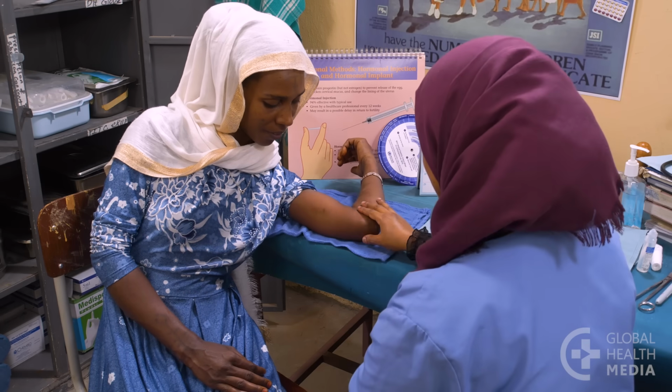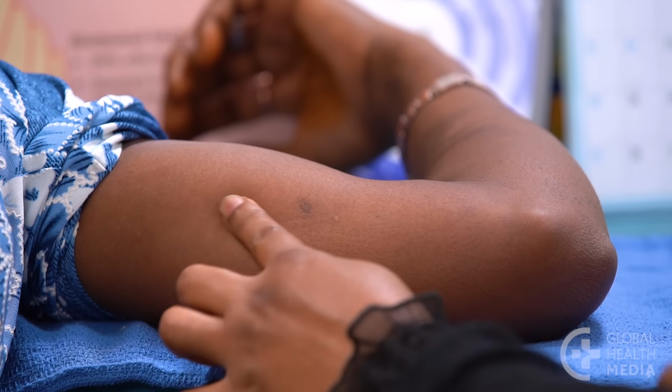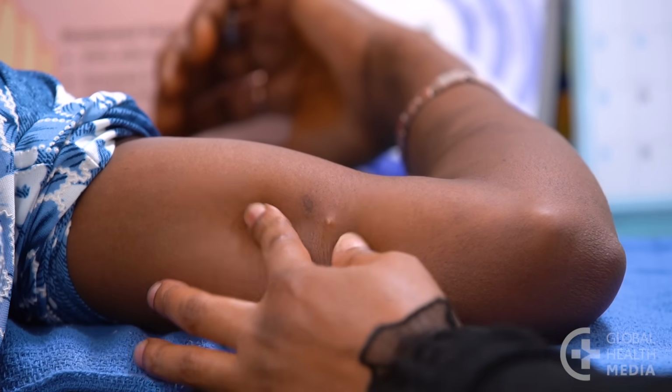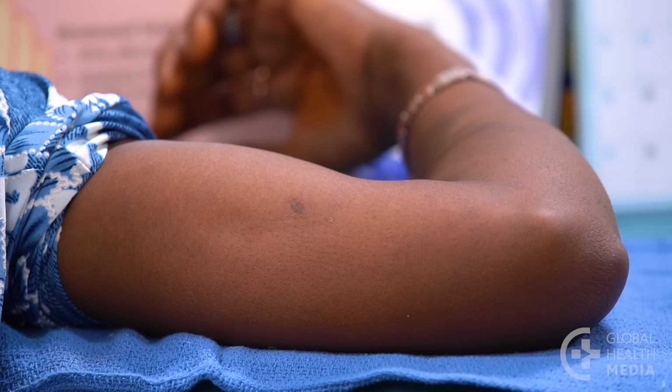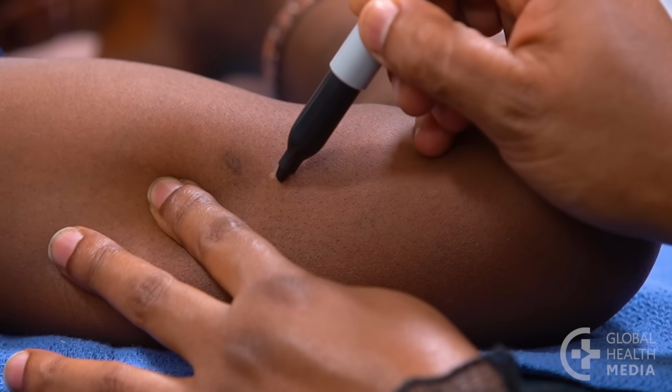Clean your hands. Then, position the woman's arm. Locate the rod by feel. If you cannot feel the implant, refer the woman to a provider with experience in difficult removals. First, mark the incision site.